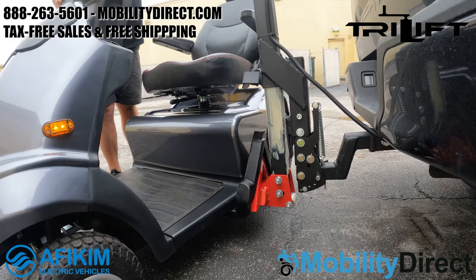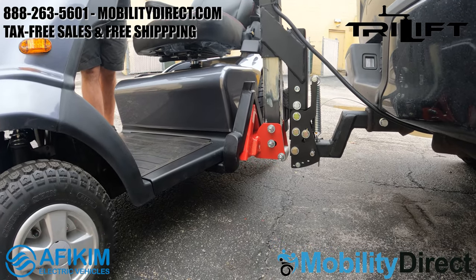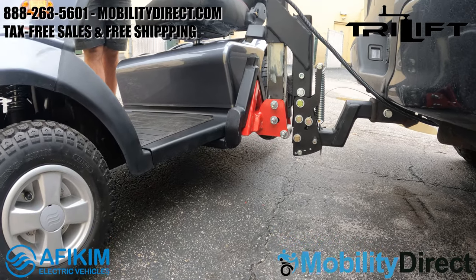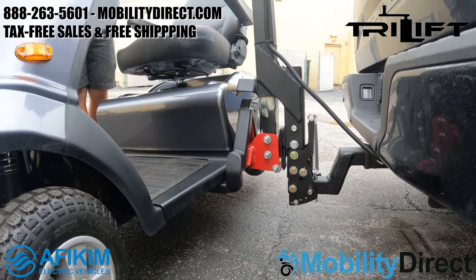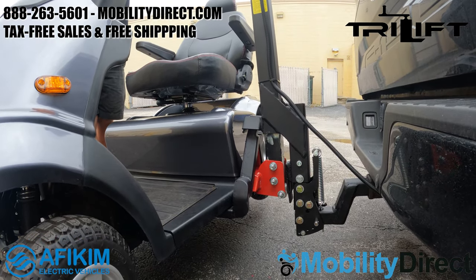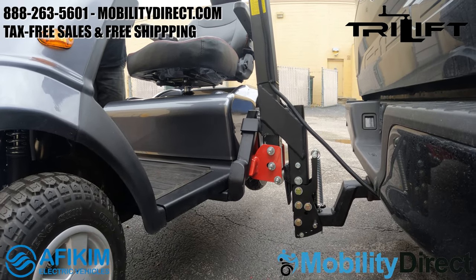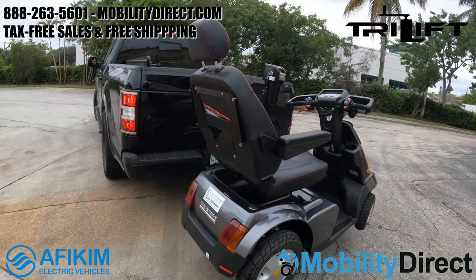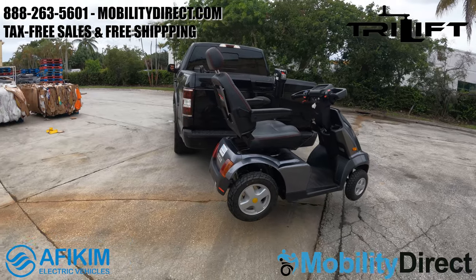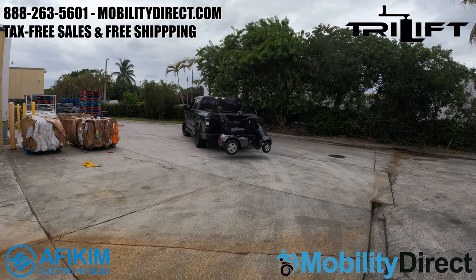We're showing you one more time with a different angle how the lift hooks onto the bracket installed on the Afikim S4. The Afikim S4 is one of our favorite mobility scooters — it's super powerful. In fact, we put the truck in neutral and towed it with the Afikim S4 just to have some fun after filming this video.